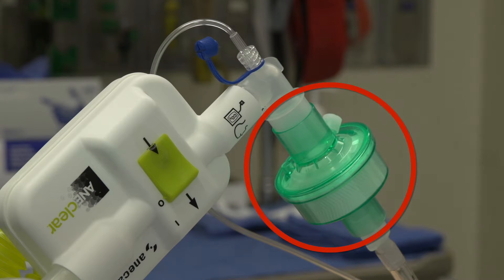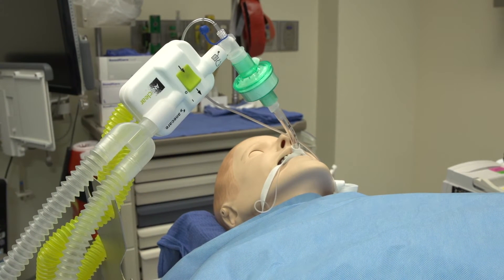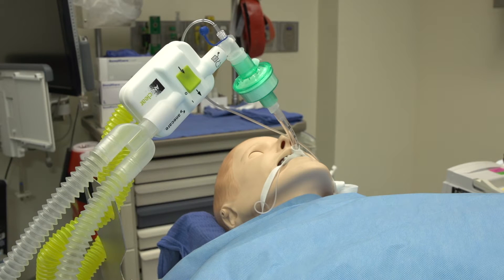The placement of the heat moisture exchanger or HME circuit filter has minimal effect on the performance of AniClear, but the performance of the HME filter is improved if it is closer to the patient. Therefore, it is best to add an HME or bacterial filter between the patient and AniClear if desired.